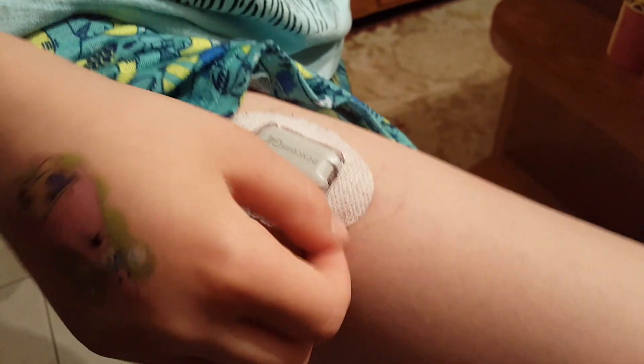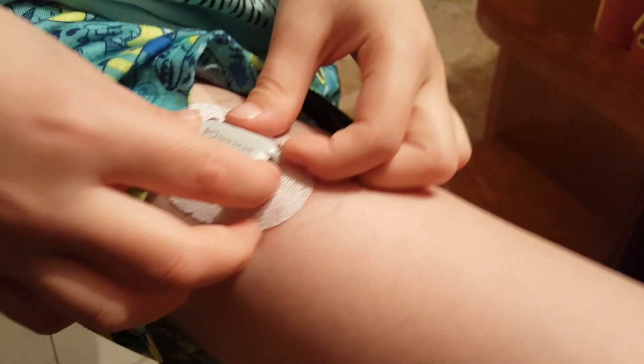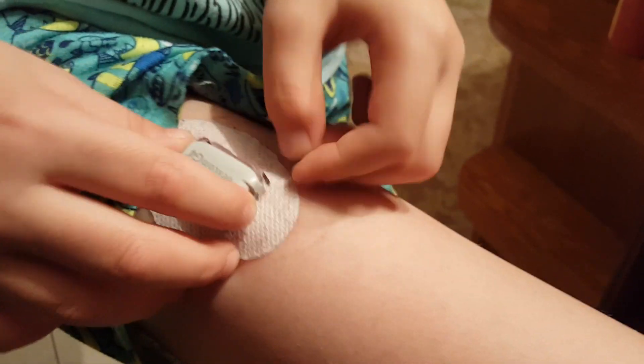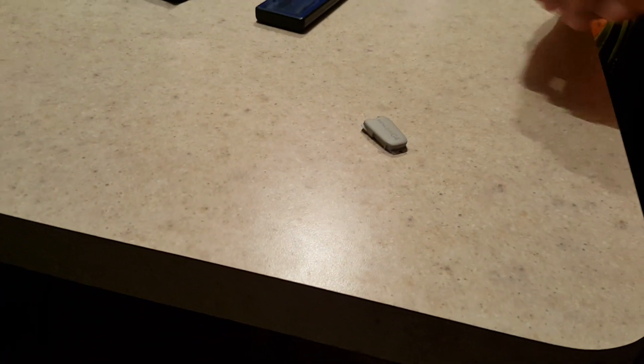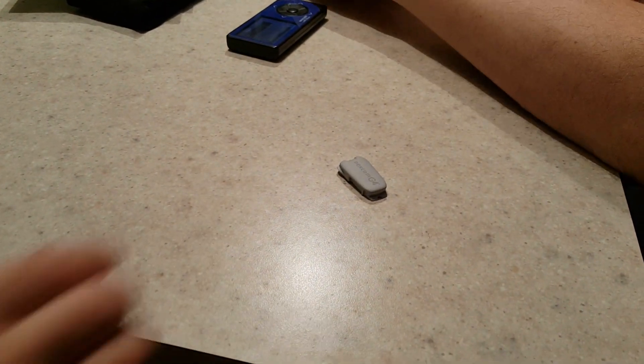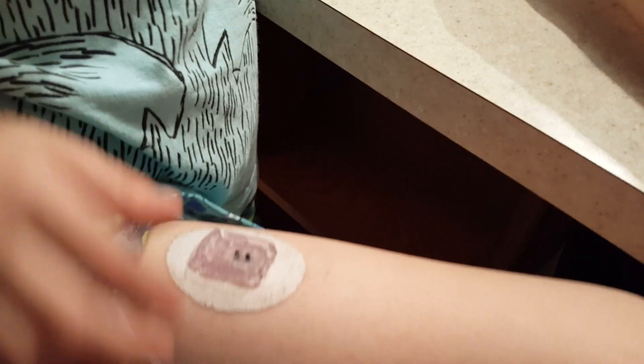Alright, set ready. Use both hands — you can do it, put a little muscle to it. Yay! So you got that on, and then you typed in the transmitter number? Yep. Then take an alcohol wipe and wipe off those contacts — you do that every time. Let that dry, and because we just put this sensor on not too long ago, we're gonna try using the same one.